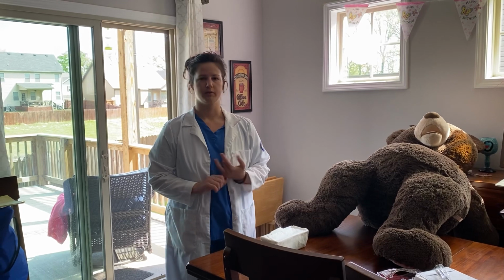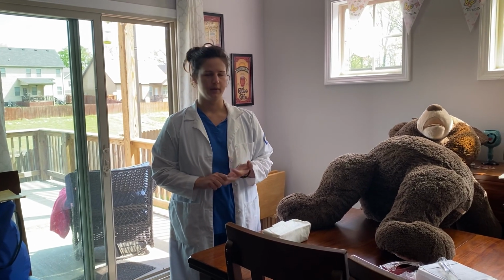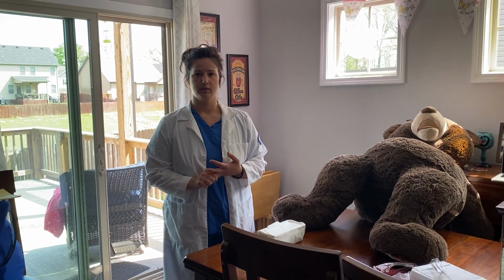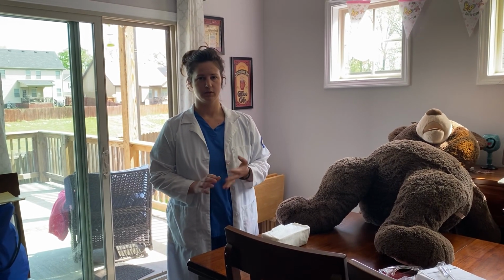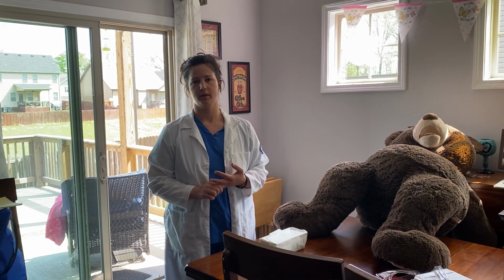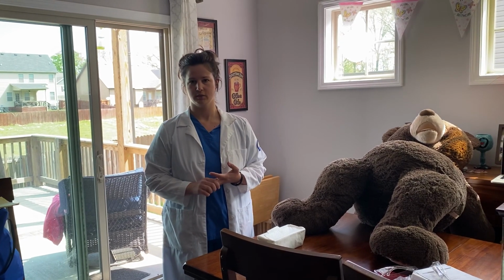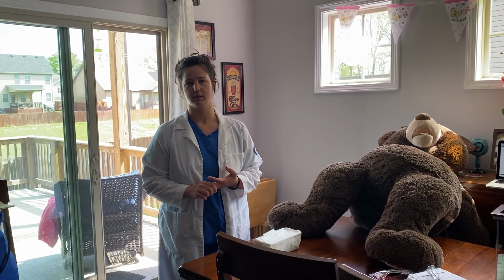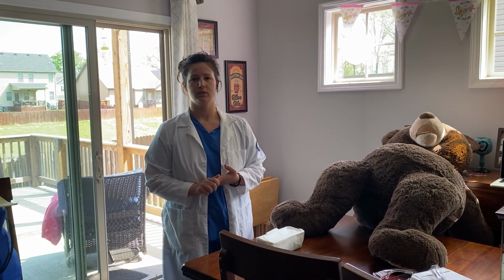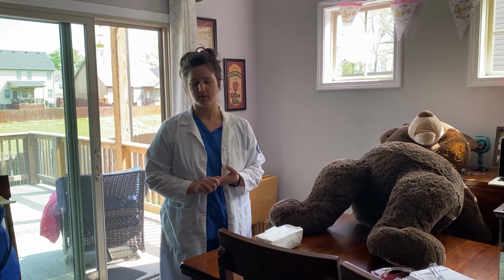patient. The first one is you verify the care plan of the client. Secondly, you want to wash your hands before and after, so good hand hygiene before and after client care or handling supplies. Then you want to verify facility procedures and policies and assemble necessary equipment and supplies needed. Fourth is to consult with manufacturer recommendations when using equipment.